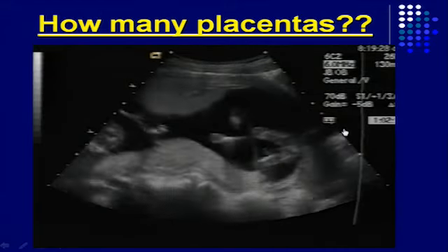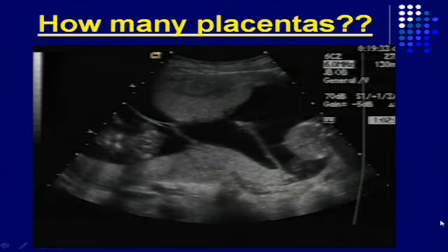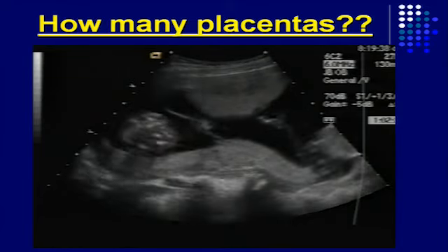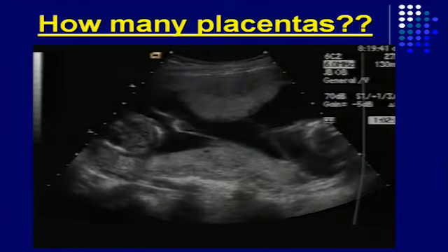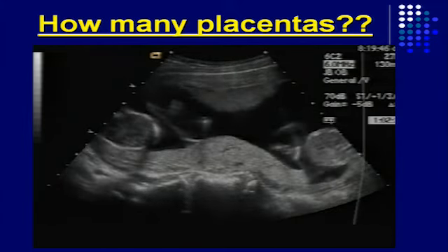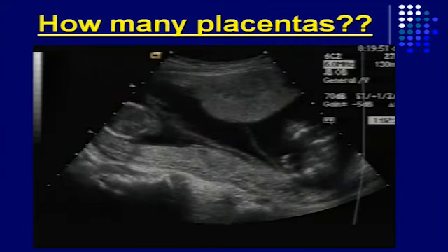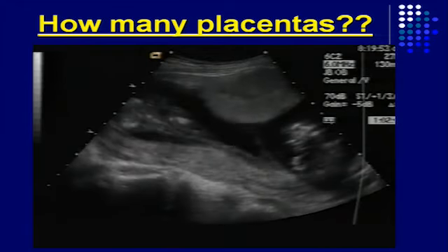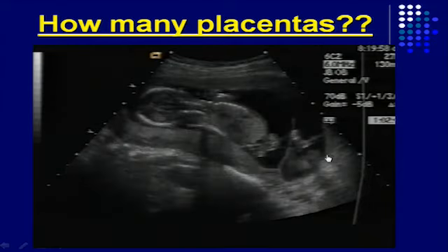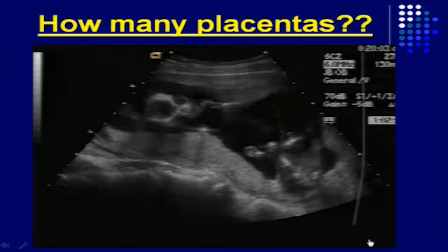Okay, so we've been looking at things. Let's look at this video clip. Tell me, how many placentas do you see? Because we're talking about counting amnions, counting placentas. So this is your quiz. Oh, come on, you guys, you can do this, look.